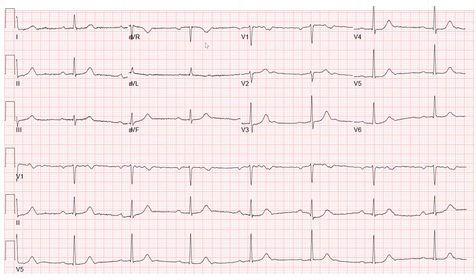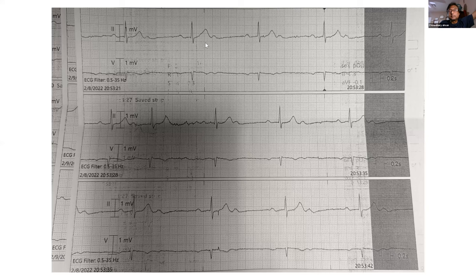Is there something on the downslope of the T wave as seen in V5? Okay, anything else? So this patient has sinus rhythm, prolonged PR, and electrolytes relatively normal. And then this happened overnight. Yes. So now going into 2-to-1.